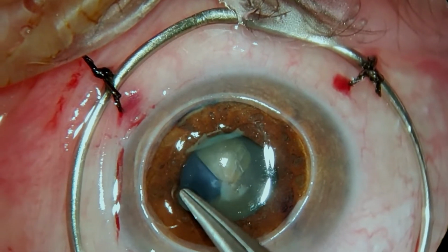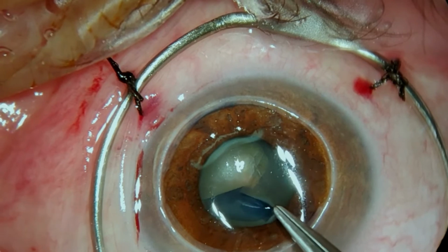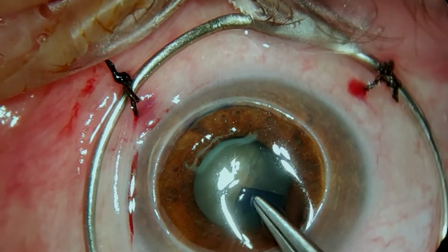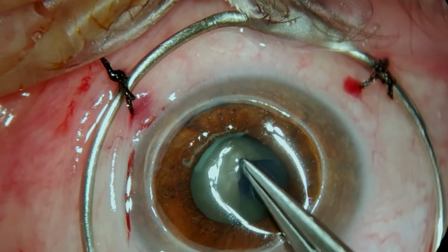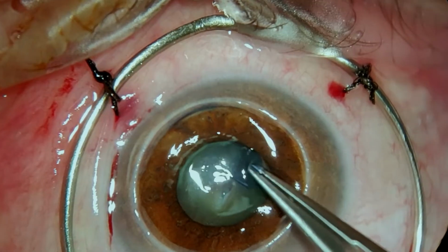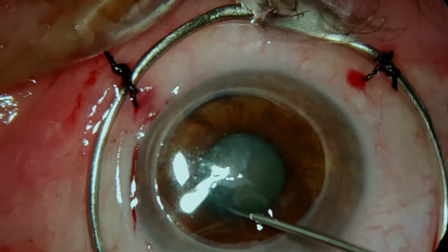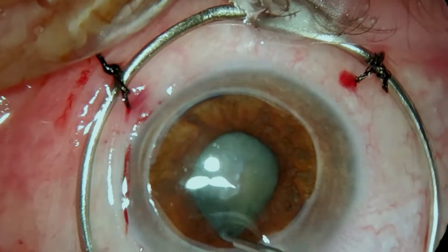Now this step is of course very important. It feels a lot different than it does doing it on a closed globe. Vector forces are quite unstable. Sometimes they're very friendly, sometimes they're not. You also have to be very careful when resting your hand on the patient's forehead not to touch the speculum, because this will change the intraocular forces.